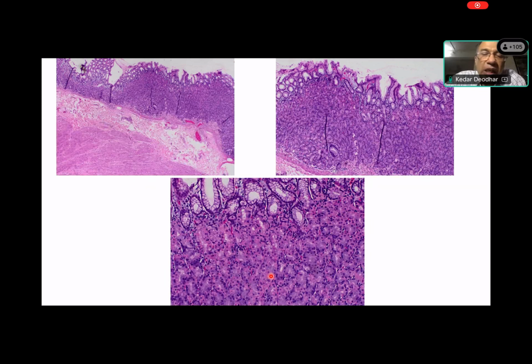These are the gastric glands. Gastric glands are generally seen in the body of the stomach, not so much in the cardia or the distal antrum. Gastric glands are composed of chief cells and oxyntic cells, so basically acid-producing cells and cells which secrete pepsinogen. Acid-producing cells, mind you, also secrete what we call Castle's intrinsic factor, which is responsible for vitamin B12 absorption.